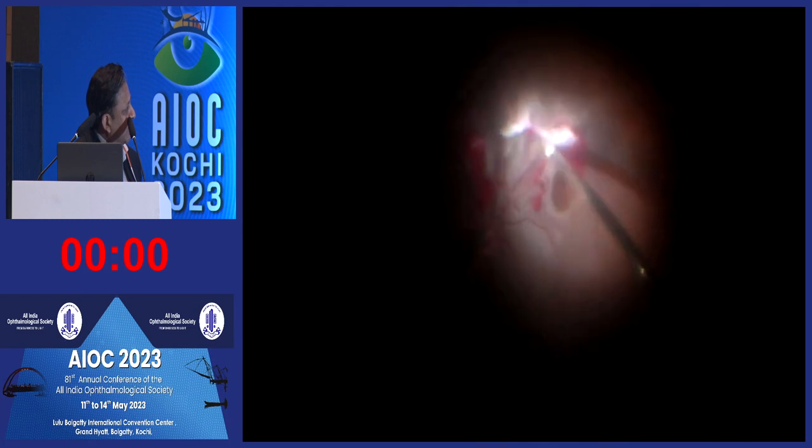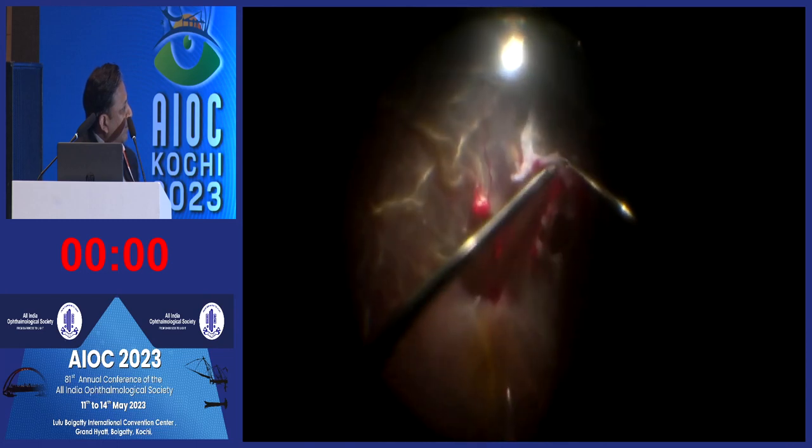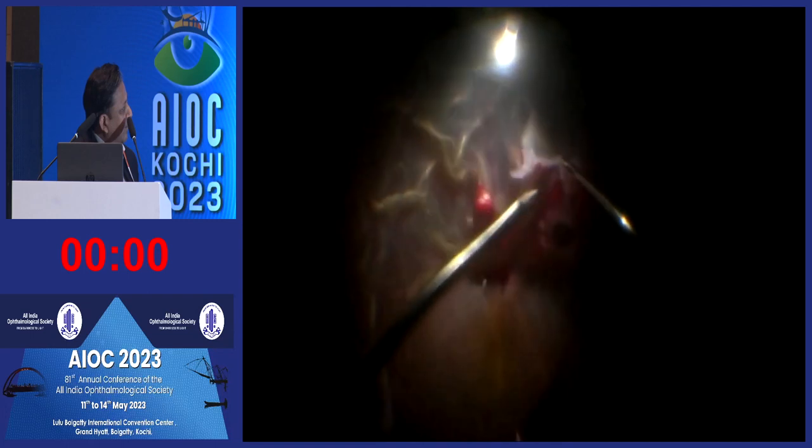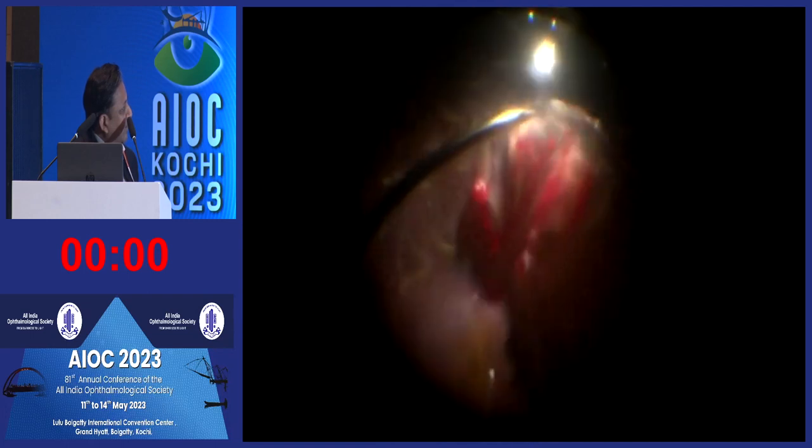Sometimes, the membranes lying in the upper hand corner are difficult to reach using your dominant hand. The non-dominant hand is then used for effective removal of membrane. Use of scissors and vitrectomy cutter with non-dominant hand is very difficult and leads to complications. This video demonstrates the ease of using arrow with the non-dominant hand. Since only the to and fro motion of hand is required, the membrane can be easily dissected using the non-dominant hand.